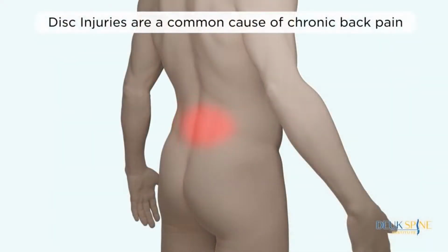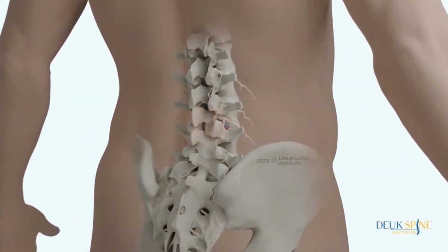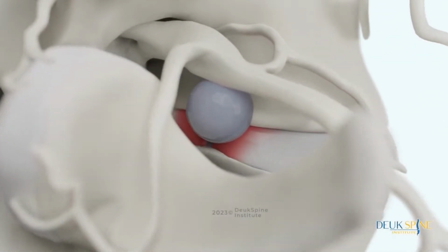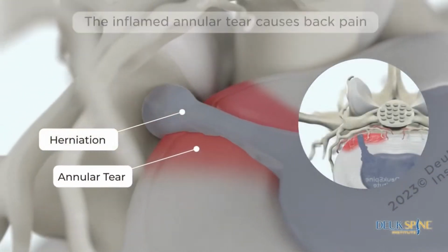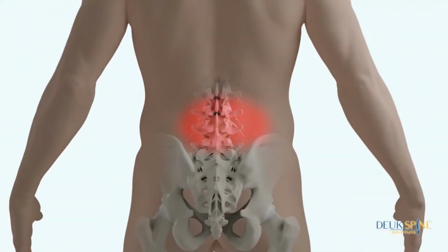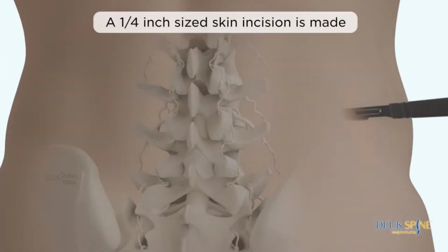Disc injuries are a common cause of chronic back pain. The inflamed annular tear causes back pain. A 1/4 inch sized skin incision is made.